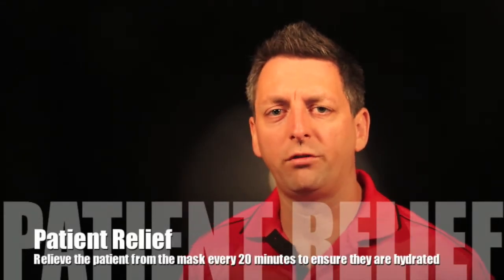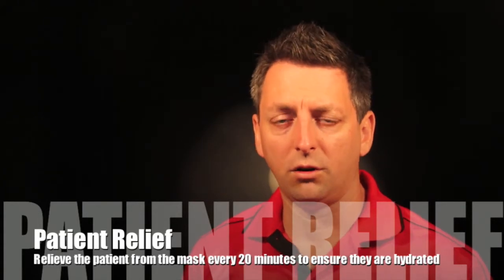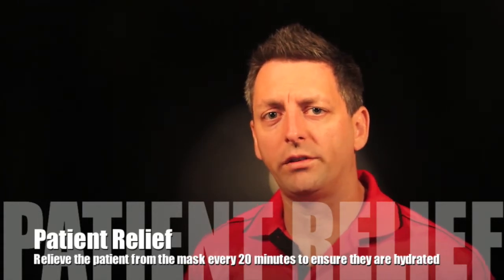I always like to take a patient's mask off about 20 to 25 minutes into the non-invasive ventilation, because it's very drying having that oxygen air shoved in your mouth continually. So I like to give them just a sip of water, not too much because otherwise they'll vomit. Just give them a sip, rub some lip balm around their lips, keep it all moist, give their face a wash. So I get a face washer or a flannel, give their face a bit of a scrub, clean their eyes out, get them all feeling a bit fresher, and then put the mask back on.